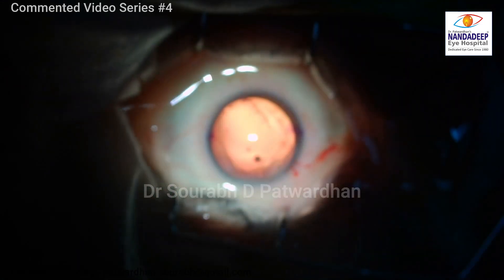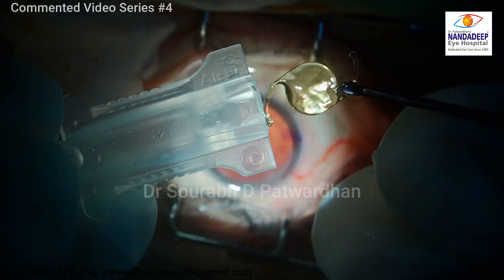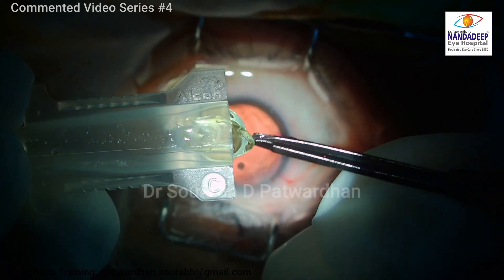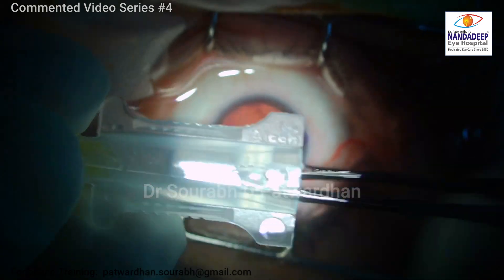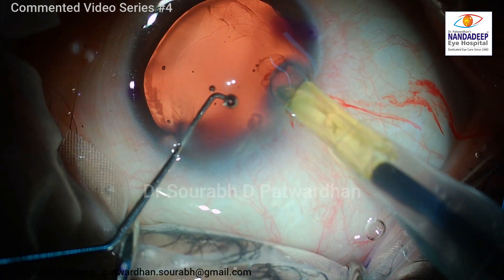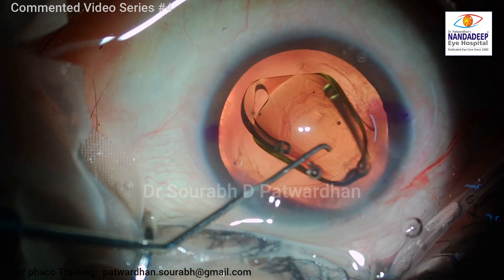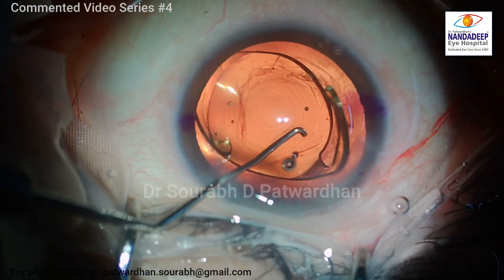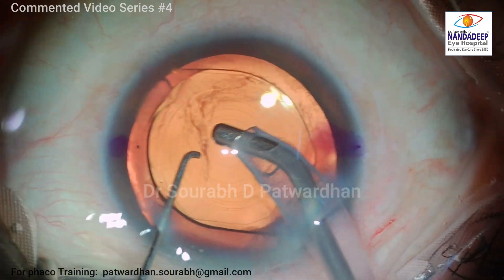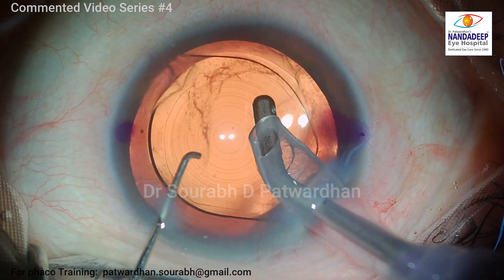This is a plus 7 diopter trifocal IOL because the patient has almost 29 mm of axial length. You have to be very careful in loading this IOL — we don't want any scratches over the surface because it may add to aberrations. The injection is quite smooth. What is important is to achieve good centration of the IOL.